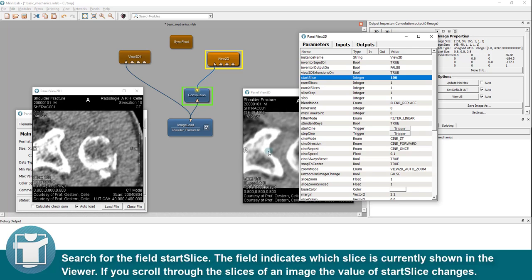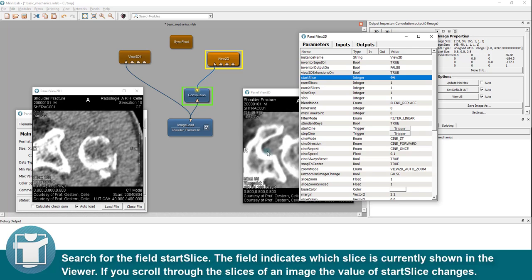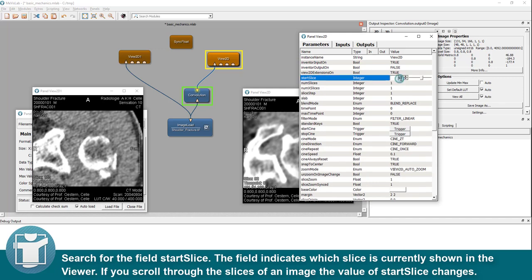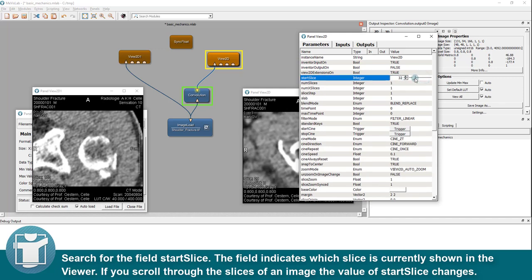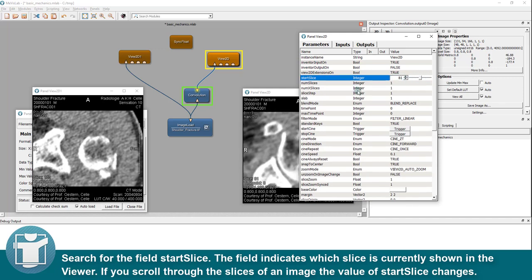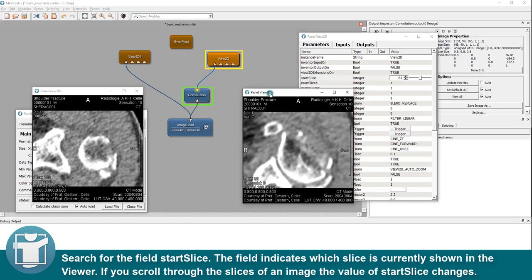This option shows all parameter fields of the module view 2D. Search for the field start slice. The field indicates which slice is currently shown in the viewer. If you scroll through the slices of an image, the value of start slice changes.